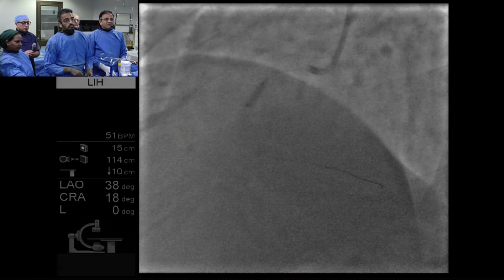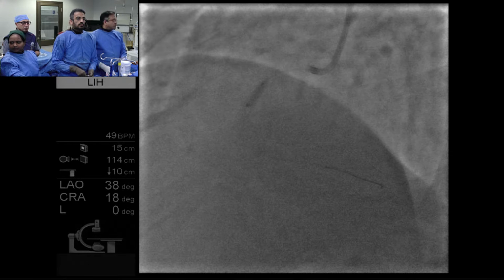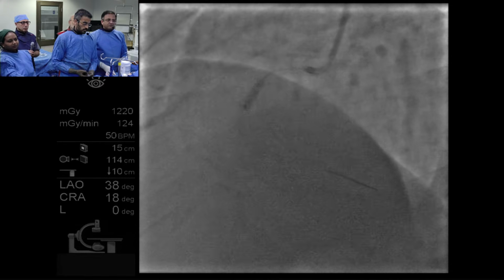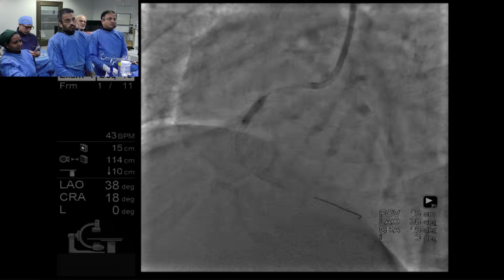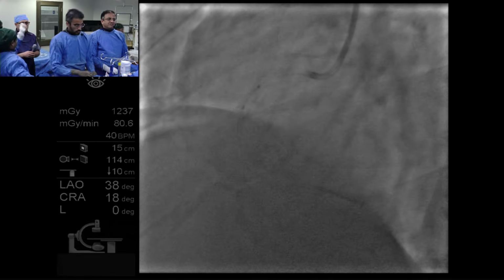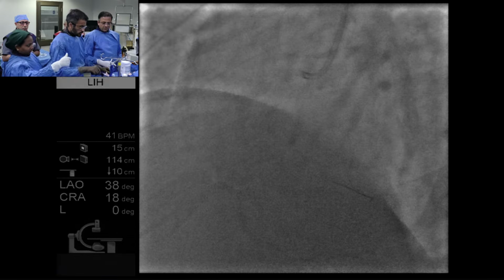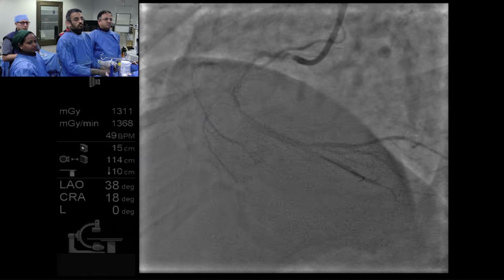Samir sir, this is Dr. Jay from Ahmedabad. Sir, in such a scenario where the segment is straight, but if you want a differential cutting, then would you like to go ahead with the scoring balloon, or will Wolverine take care of those things? And second question, there are 2 layers of stent. In that case, would you go ahead with another stent, or would you like to go ahead with DCB, drug-eluting balloon? I think, anywhere that scoring balloon works, this will work.